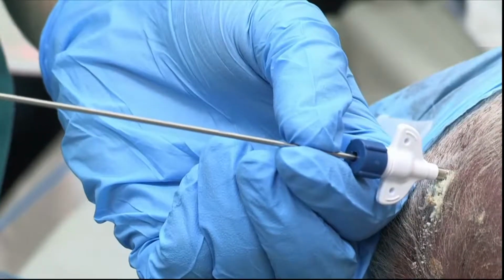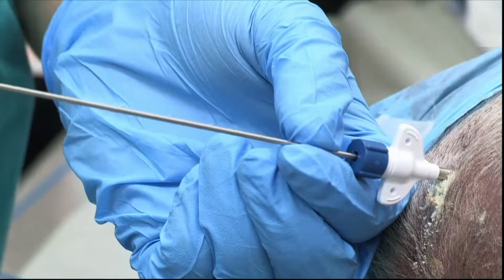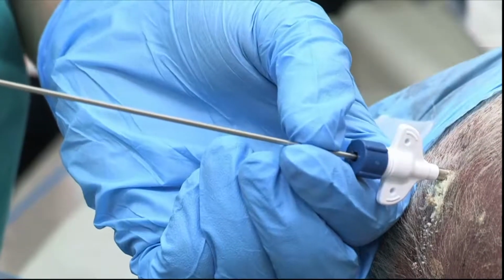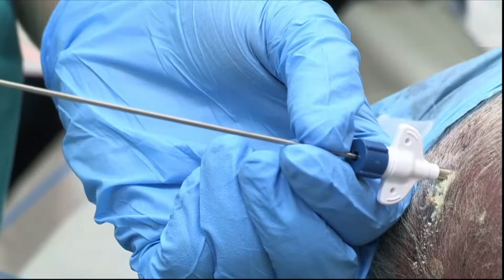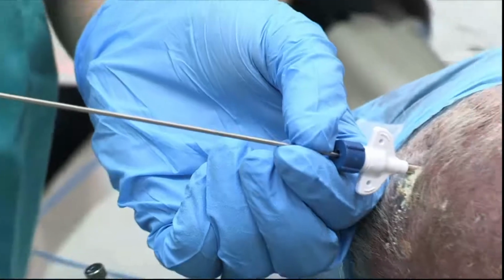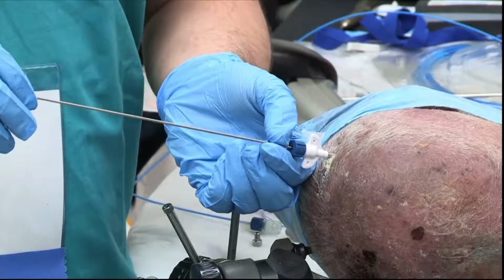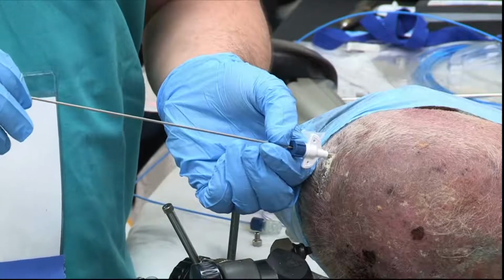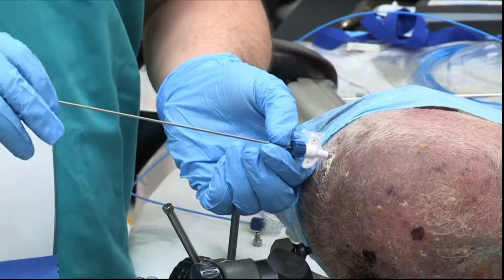Once again, we have seen, especially in pediatric patients, that you can strip dura away easily, and there's not going to be that resistance, so you can cause epidural hematomas. When you did your planning, you were mindful to avoid the sulcus or any arteries, but you can feel those sometimes, some resistance. So you want to be delicate, and you want to get past those.